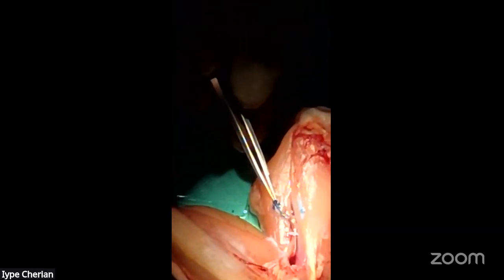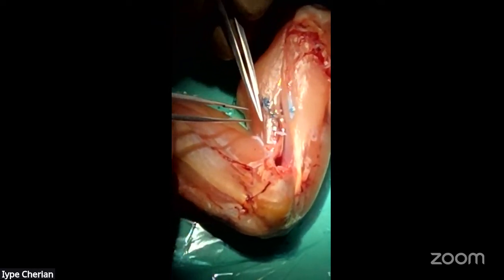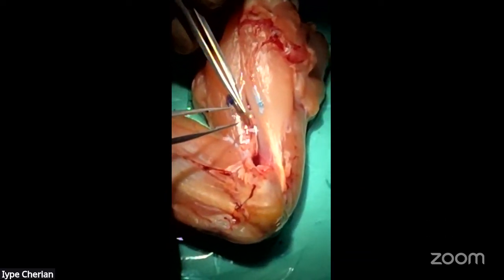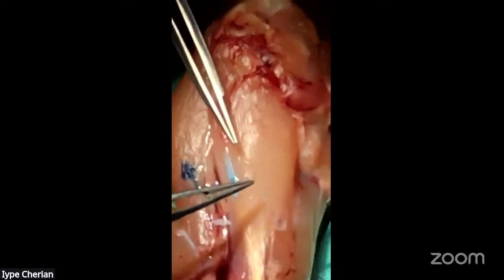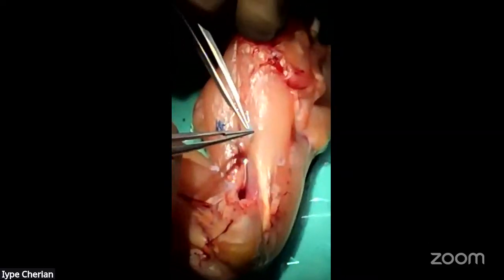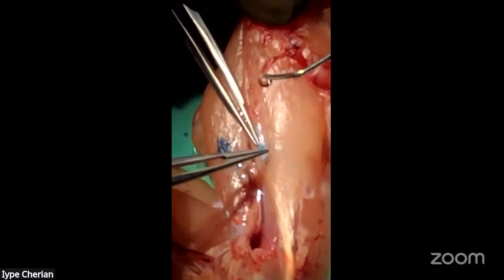This is 11-0. Yeah, it's 11-0. Can you see that? It's a much smaller needle, but this is a different company. Vitalon is bigger, the other is smaller. Oh, I love this. This is the one I need. Can you increase my zoom? Focus is fine. Yes. No, I'm good.